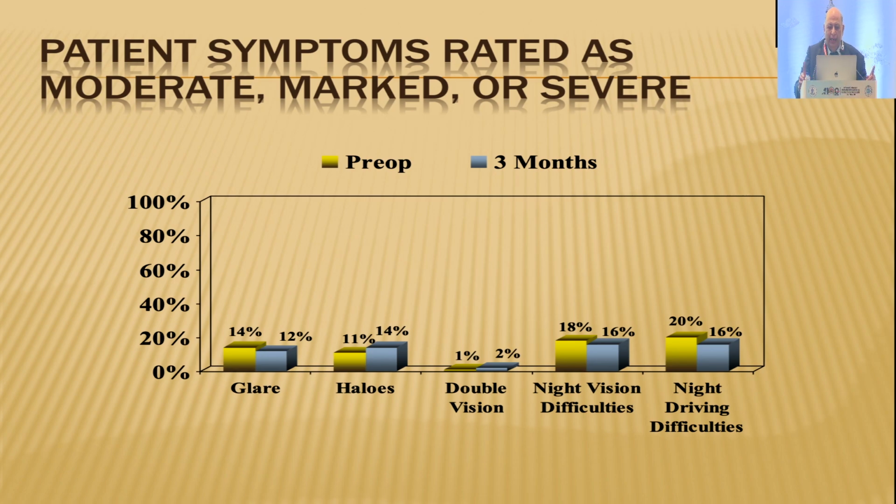Night driving is a vision difficulty; you have to tell the patient that he will see a little less at night. And if he has to read fine print, he needs a brighter light. That is about it. Once he knows that, he is happy with it. Also, you have to tell him that his reading distance is set, not variable.